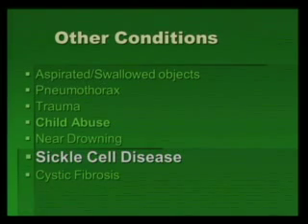Realize that, residents, when you say there are bilateral infiltrates, the clinician is thinking pneumonia. You say the word infiltrate, they think pneumonia. We know that infiltrate is anything that infiltrates. Hemorrhage is an infiltrate, tumors are infiltrates, pneumonia is an infiltrate, pulmonary edema is an infiltrate. But you say infiltrate, the clinician immediately thinks pneumonia.